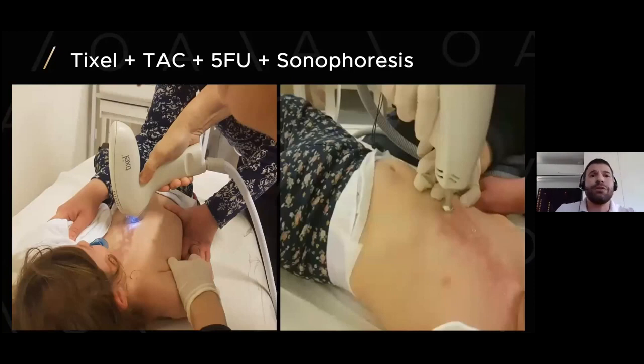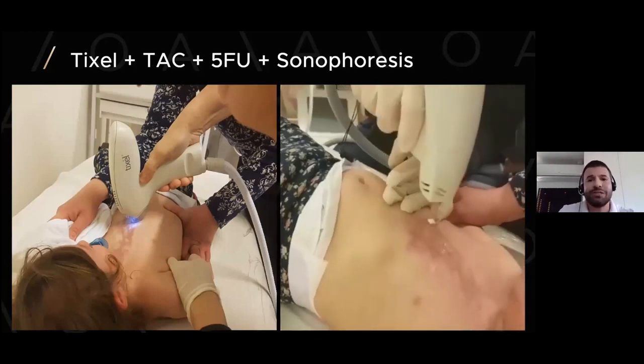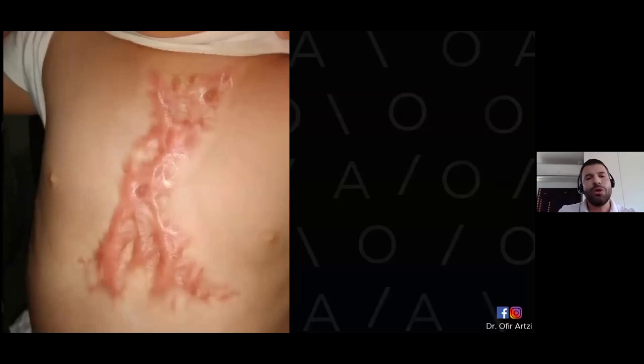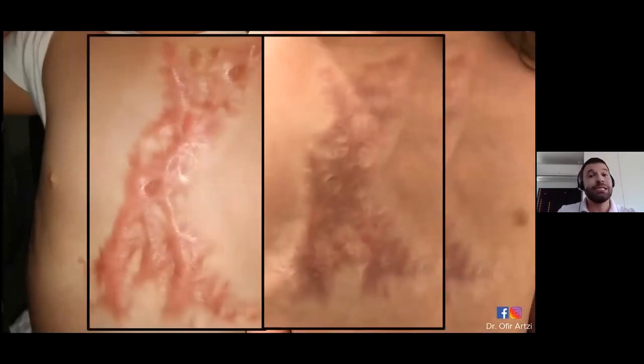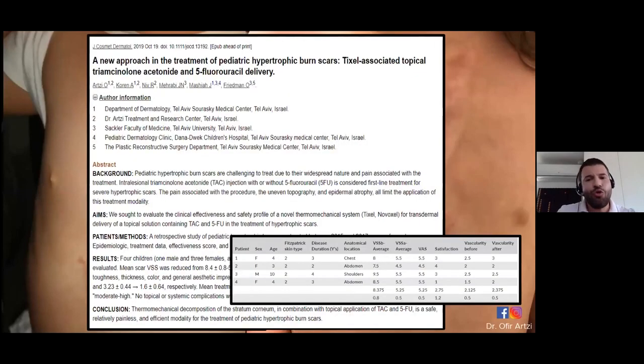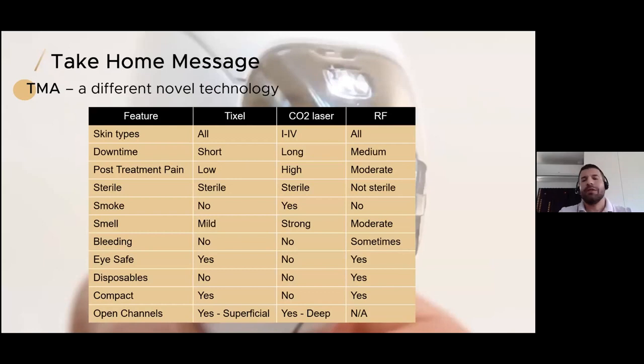This is Tixel followed by triamcinolone 5-FU and sonophoresis. You can see how we do it. We discharge our patient, though I'm not sure it's really needed, with Tegaderm in order to ensure that the scar is saturated with triamcinolone and 5-FU. This is the before and this is the after. Again, this is a closer magnification. And you can read, we described 4 patients. We have very nice result. And I think for the pediatric population, it will open the gate for more studies and for more treatments which are non-painful. And this is the most important.